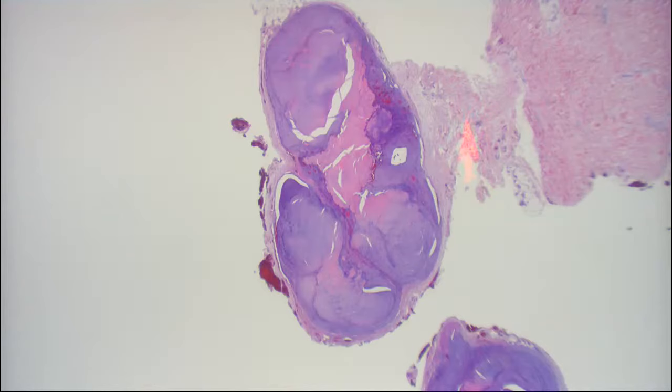I think it's benign. Very circumscribed, right? Very symmetrical. Okay, so again, it's in the subcutaneous fat, but it's really not huge. You got the whole thing out with a punch. So it's probably a little small dermal-based nodule, maybe even a subcutaneous nodule.